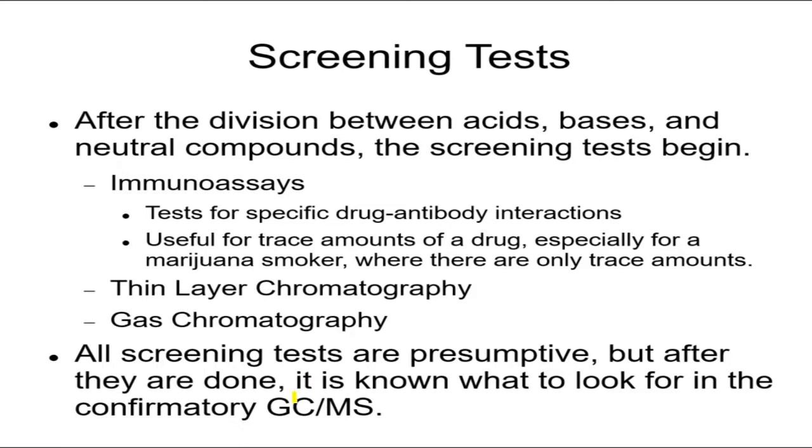To know exactly what it is, what you do after that is you put it in the GCMS. That's a gas chromatography mass spectroscopy device. The mass spectroscopy will tell you pretty much exactly what it is.